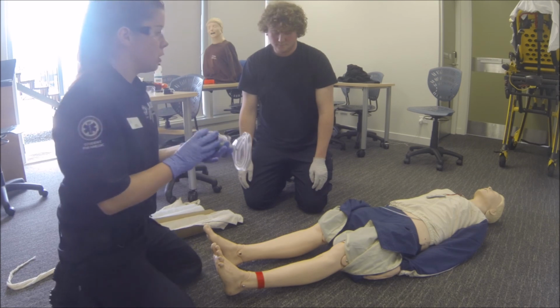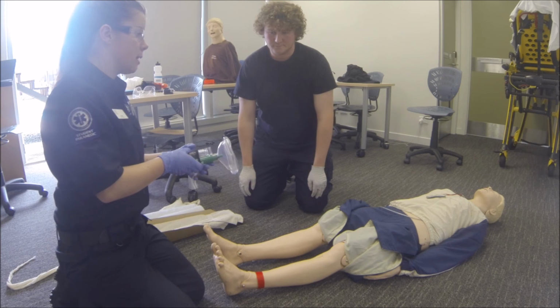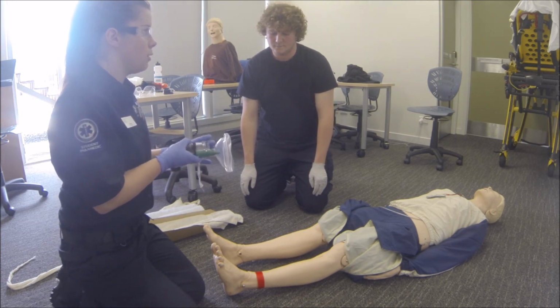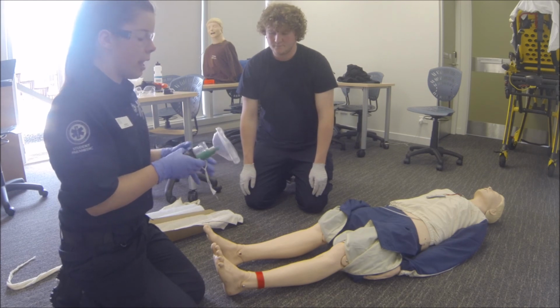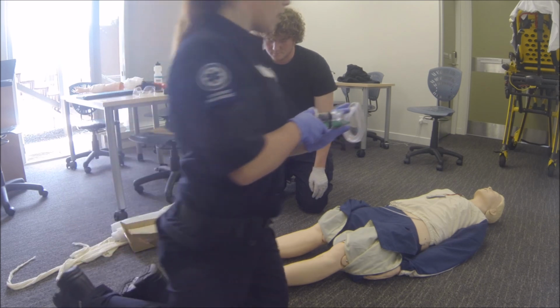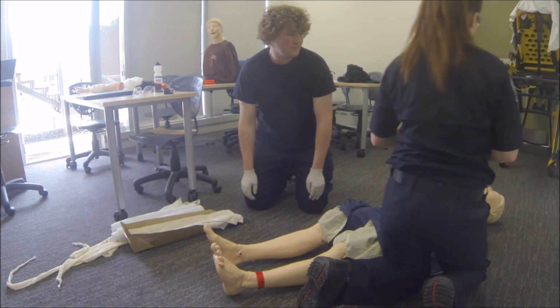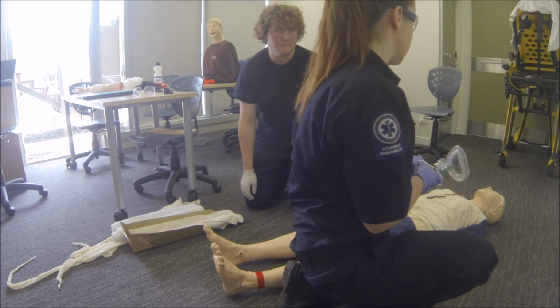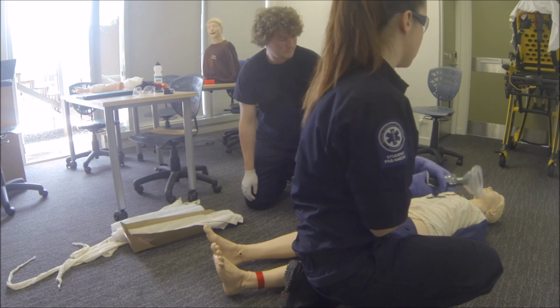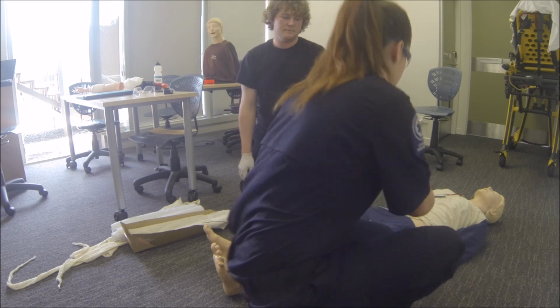Now, so I'm just going to give this to you. You can inhale it yourself. Before I give it to you, I'll just tell you there can be some side effects when you take this, and they include drowsiness, euphoria, or you may feel a bit nauseous. So I'm going to give this to you. I'll put it around your wrist, and you can inhale it yourself. I'll just put the mask on your face like this. It should take no more than 2 to 3 minutes to take action. And if you start to feel uncomfortable, you're in control. So you can take the mask off your face, and it should start to wear off in another 2 to 3 minutes.